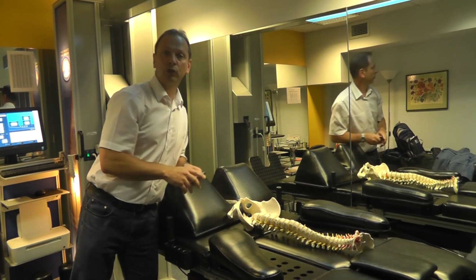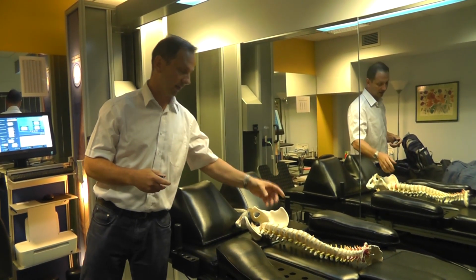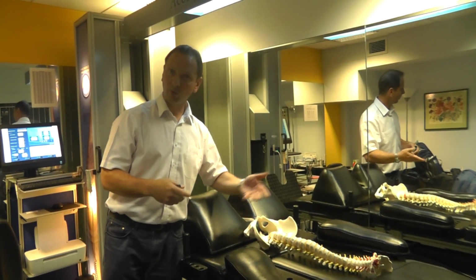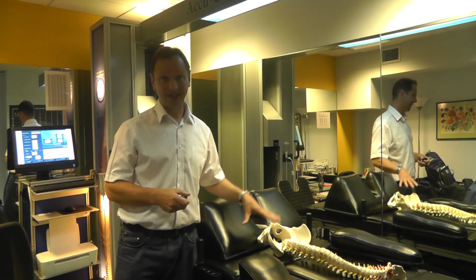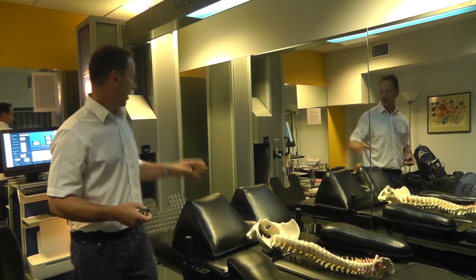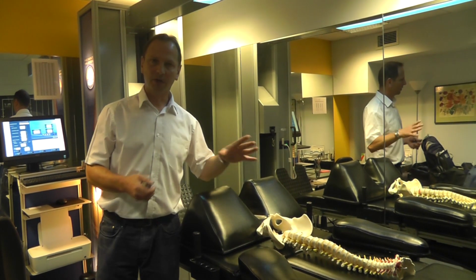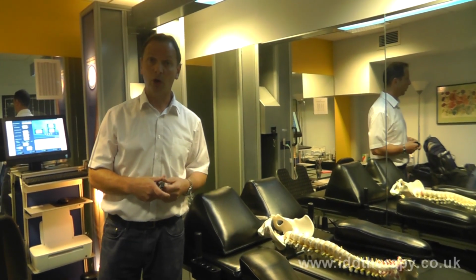We use a longitudinal mobilization when the joint is open, and that is relieving tightness and stiffness in the segment, helping with mobility. So there are quite a few factors which make this different from traction of old, and this angling capability makes IDD therapy much more precise than treatments of old.